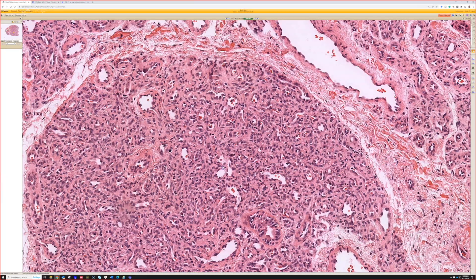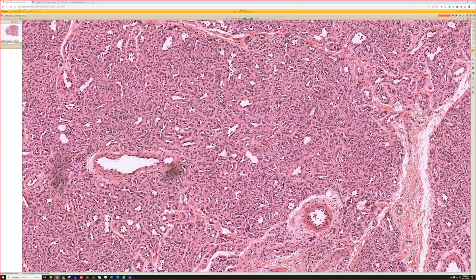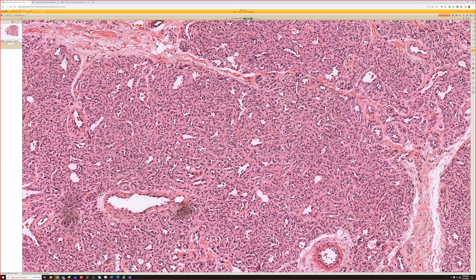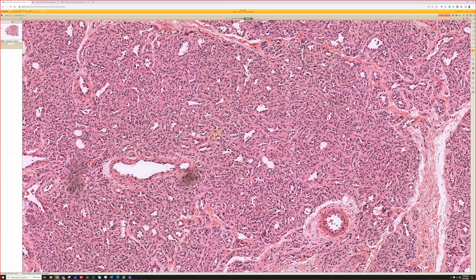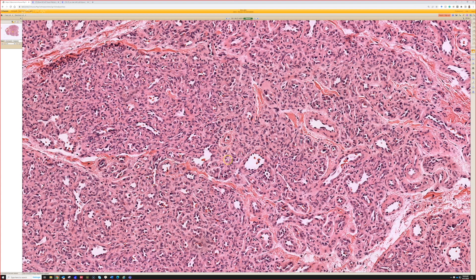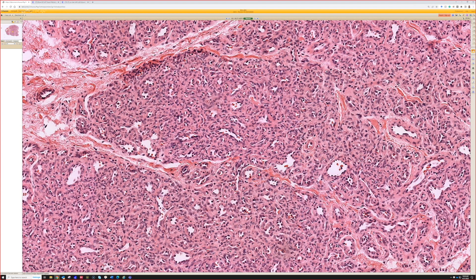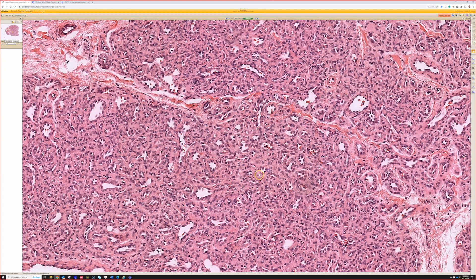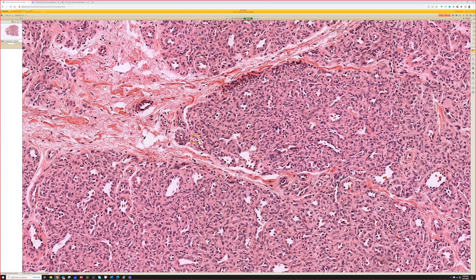In this case, we don't need that at all — it's obvious. Also, these are usually in babies, and they begin to regress, though variable amounts can be left behind as a person gets older. These are also unique because the endothelial cells are positive for GLUT-1, whereas pretty much all other vascular lesions are negative for GLUT-1. GLUT-1 is a glucose transporting molecule — it's also positive in normal red blood cells, which serves as a nice internal control, but that can be problematic when there's a lot of blood. You have to look at the actual endothelial cells when you do a GLUT-1 stain.